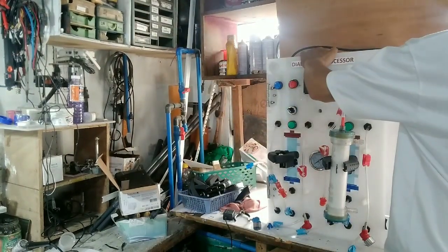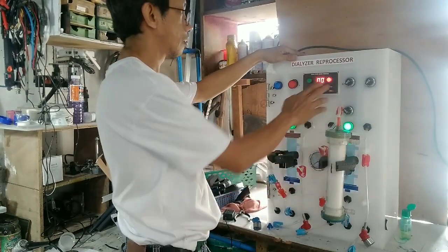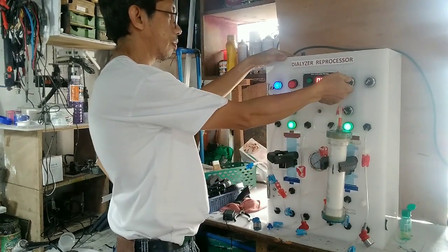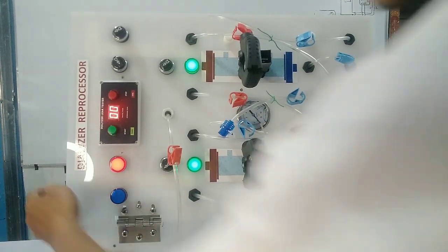Papakita ko sa inyo kung paano nagfa-function ang leak tester. Yung dalawang kulay green na ilaw ay yan po ang sa tubig o sa solenoid control. Yung pula sa blood pump at yung blue sa air pump.